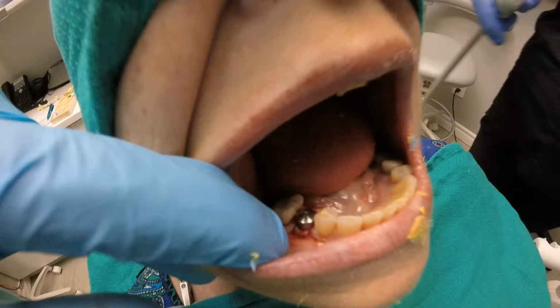In the posterior, I'm a little bit less diligent in this regard, and usually what I ask my lab to do is just over contour the actual crown that they're going to give me, or contour it all the way down to the gingiva so we get a nice emergence profile. Usually these things are back in sufficient time such that when you're inserting this crown for the patient, it's going to have a beautiful emergence profile.